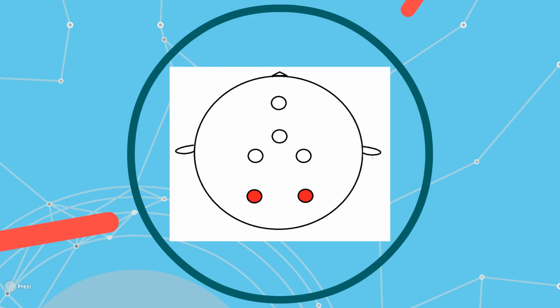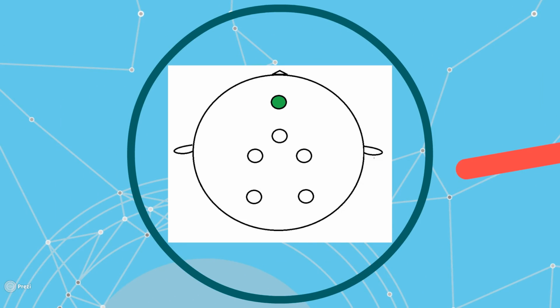Two more electrodes will be placed on the occipital lobe on non-hair-bearing regions, which will detect SSVEPs with two more targeted movements. Finally, one electrode will be placed on the frontal lobe where ocular artifact is the strongest.